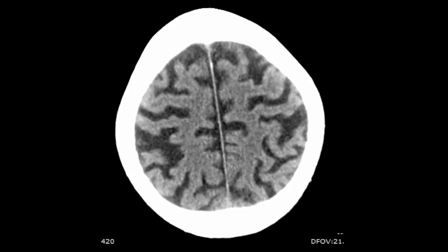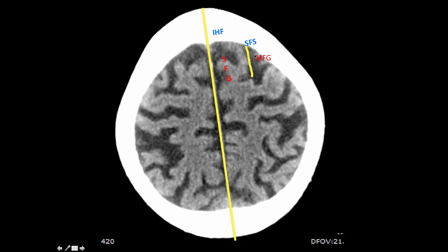When looking at the axial images, look at it like a clock face. From 12 o'clock to 6 o'clock position we have the interhemispheric fissure. The next gyrus is the superior frontal gyrus, then the superior frontal sulcus, then the middle frontal gyrus, then the pre-central sulcus. Notice how the superior frontal sulcus joins the pre-central sulcus.